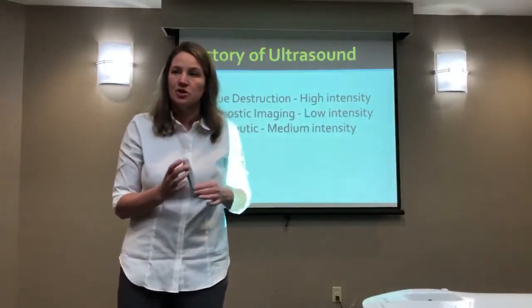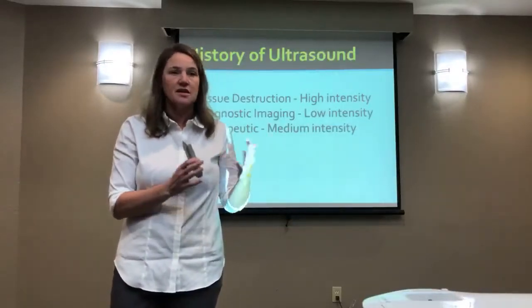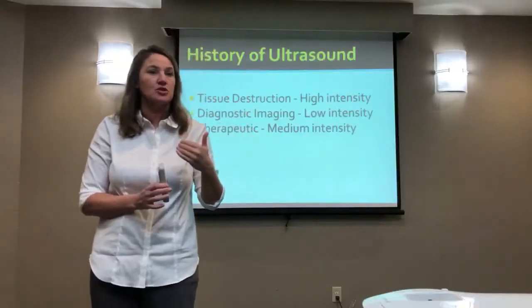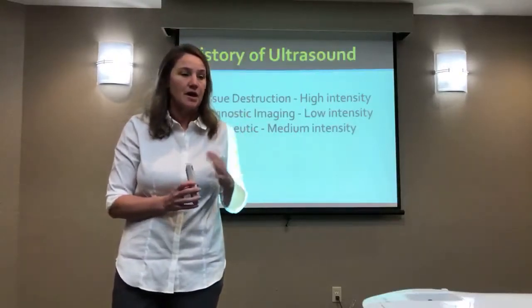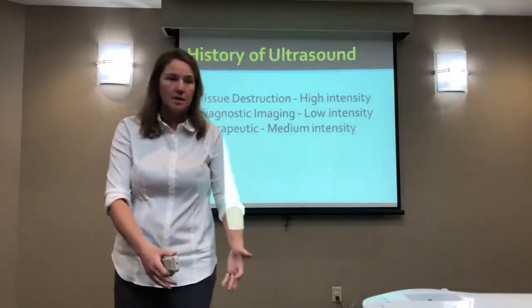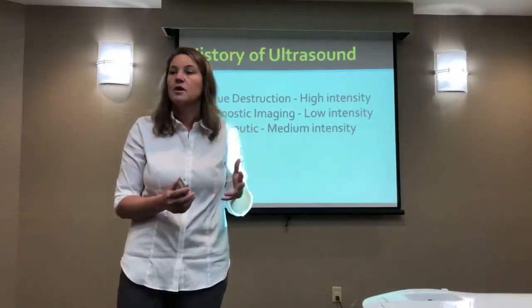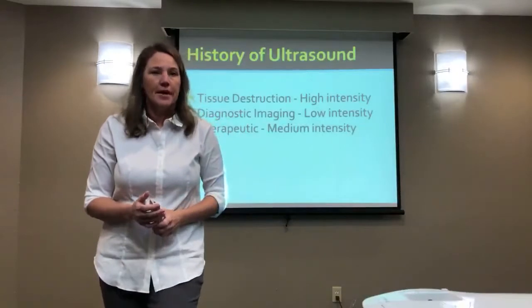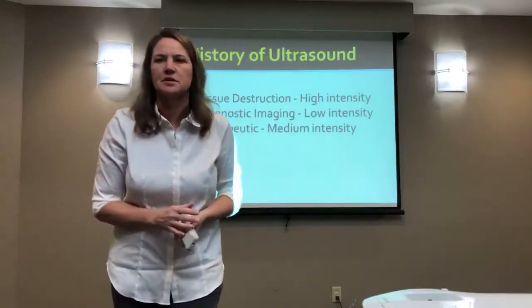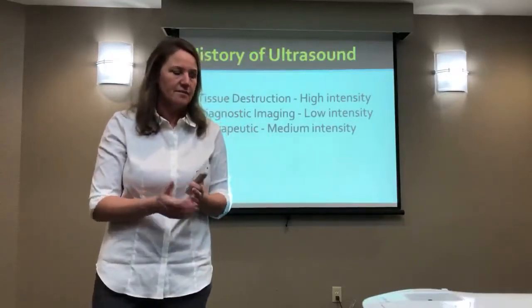There's also diagnostic imaging, which is the other extreme. It's a low level of ultrasound. It's not enough to necessarily change physiology, but it bounces off its target to give you a picture or a diagnostic tool of some kind. I use it for assessing blood flow in the lower extremity by doing an ankle brachial index. If a patient is suspected of having a DVT, they do an ultrasound to diagnose blood flow. Those are all considered diagnostic ultrasound levels. Everybody's pretty familiar with somebody who's pregnant getting a diagnostic ultrasound. It's used for many, many purposes to diagnose things. That is also ultrasound, but it's a different frequency and intensity.